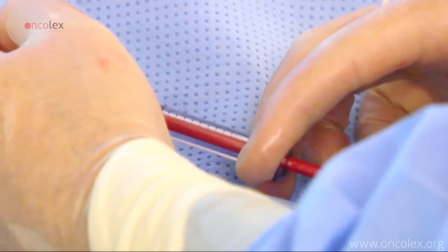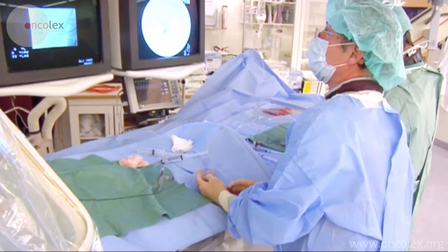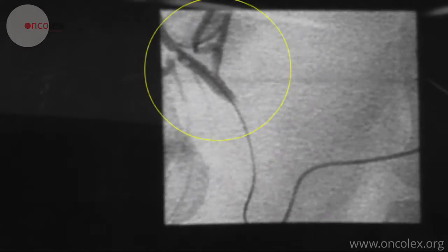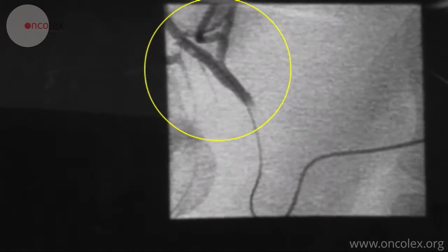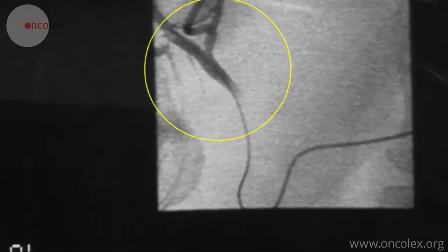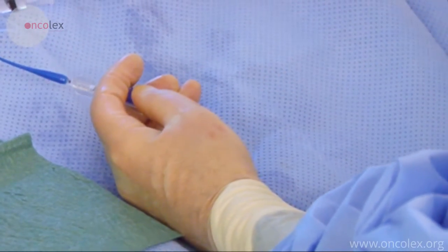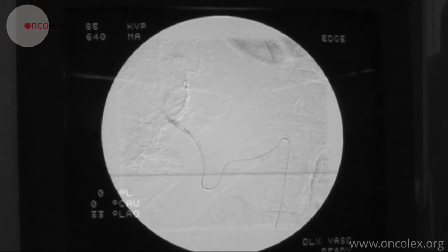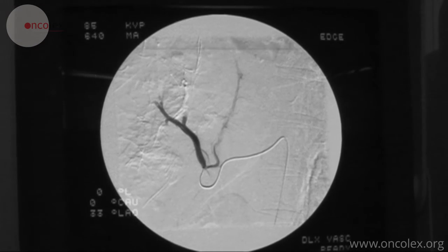The micro-catheter is gradually pulled out as the arteries become blocked. Finally, the results are checked with angiography.